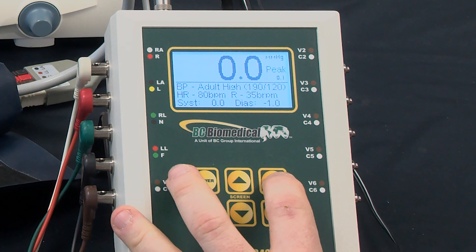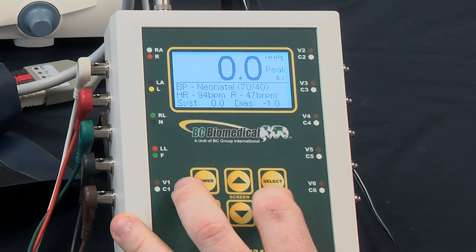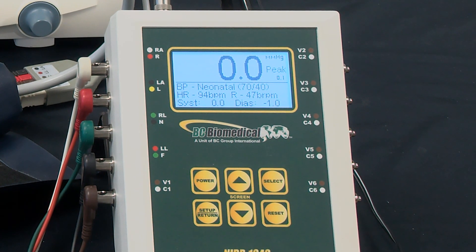We can cycle through and get to other respiration rates. In this case the neonatal should show 47 breaths per minute.